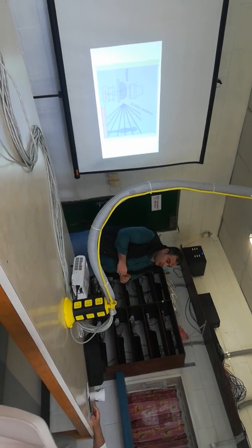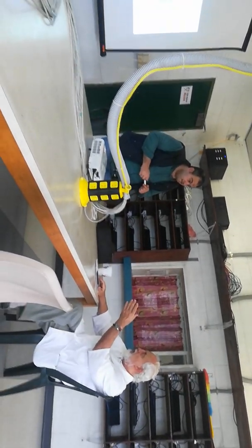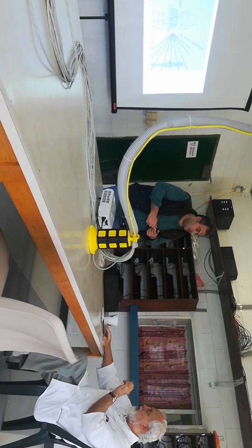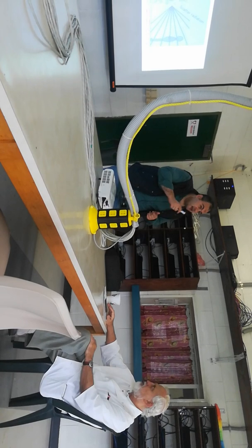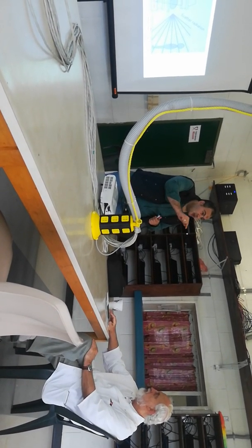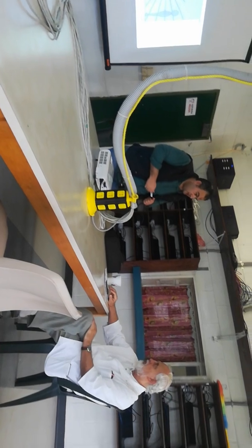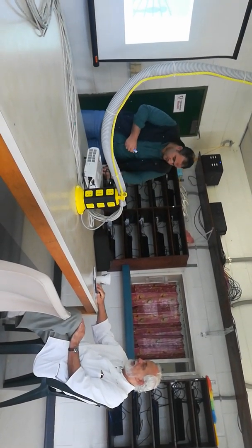But when you have the automatic mode, for example in the CT, the C-arm has automatic and manual. You can set the kV. We were never trained about this actually. I read in the manual that you can change from automatic to manual and set kV and milliampere, so we can maximally lower the absorption for the bone we can give. Yes, definitely. Thank you very much.